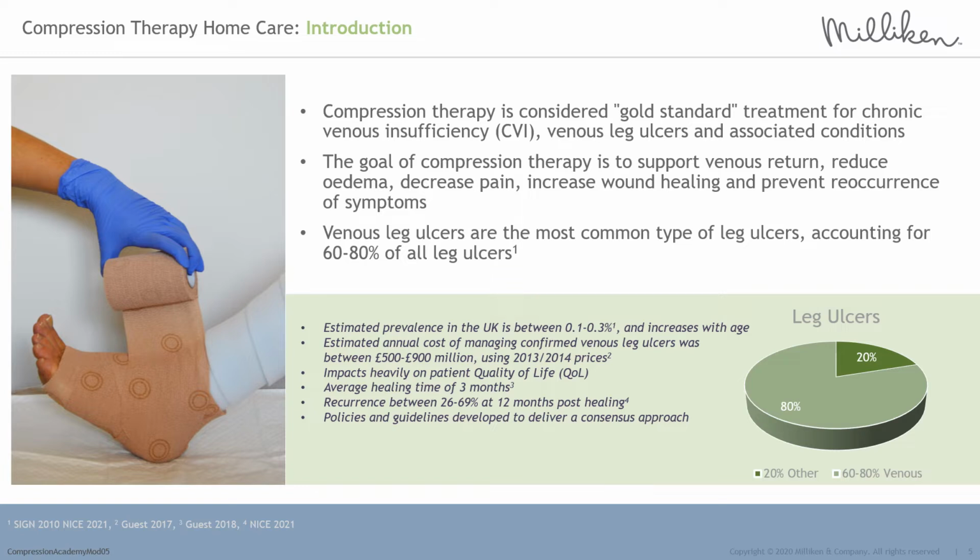Compression therapy is considered gold standard treatment for the management of chronic venous insufficiency, venous reflux and associated conditions including edema, venous leg ulceration and skin conditions such as venous eczema. The goal of compression therapy is to support the underlying venous system and structures, aid venous competence to improve venous return, reduce limb edema, decrease pain and increase leg ulcer healing rate.